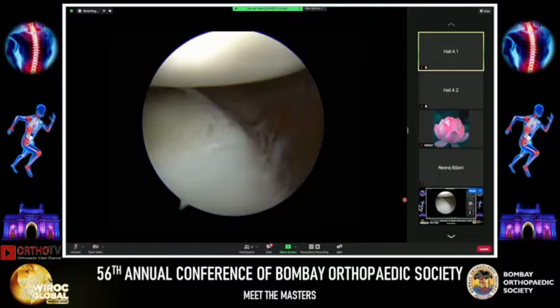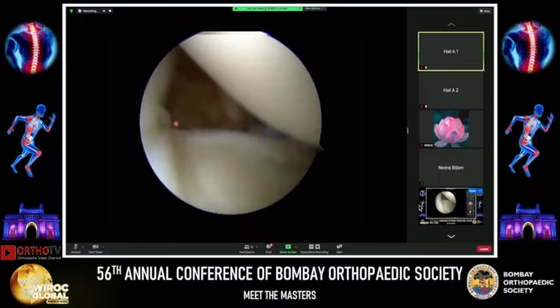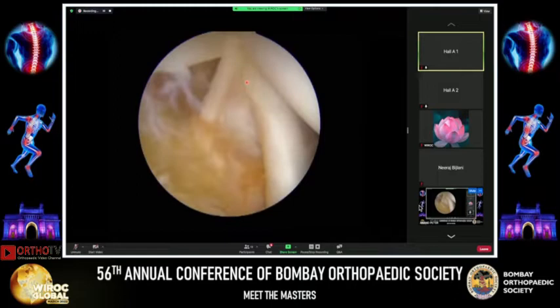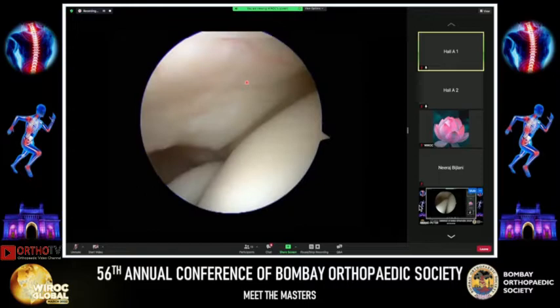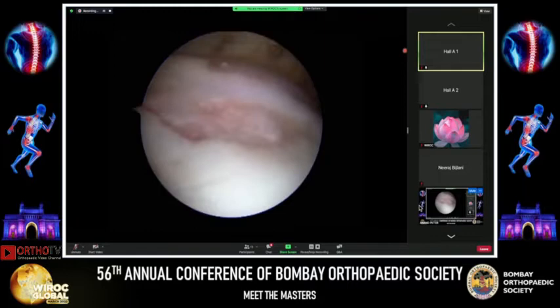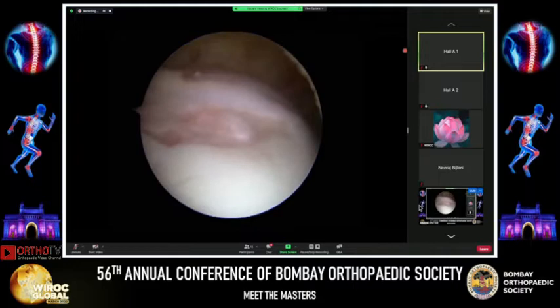We complete our diagnostic round by looking at the posterior labrum, which looks okay. We then look at the subscap and the middle glenohumeral ligament. There's no humeral avulsion of the glenohumeral ligament, so no HAGL lesion. The biceps tendon is normal, as is the biceps pulley, and the rotator cuff is normal.